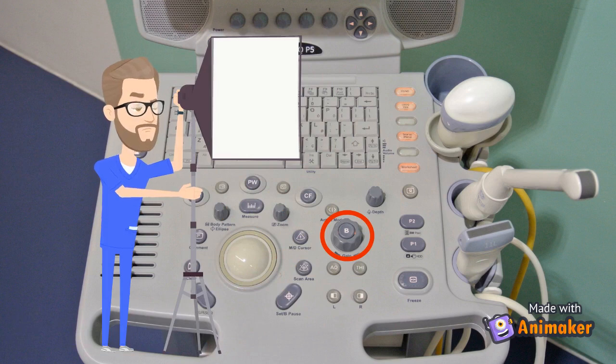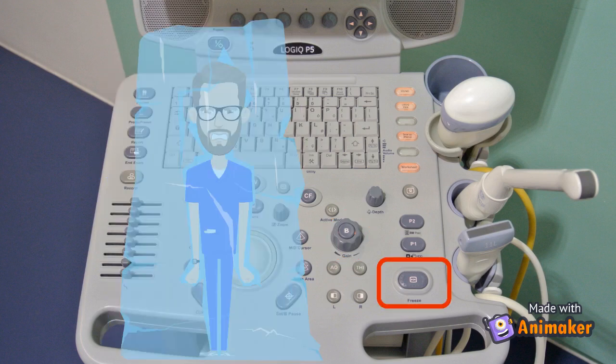The gain knob will adjust the overall amplification of the resulting ultrasound image. This can make structures appear brighter or darker with a simple twist. Finally, the freeze button will allow you to take a snapshot of what you are looking at. This will record the last few moments of imaging and bring them up on your screen. It will also allow you to scroll using the trackball we just discussed to choose the best image you can find to include in your reports.